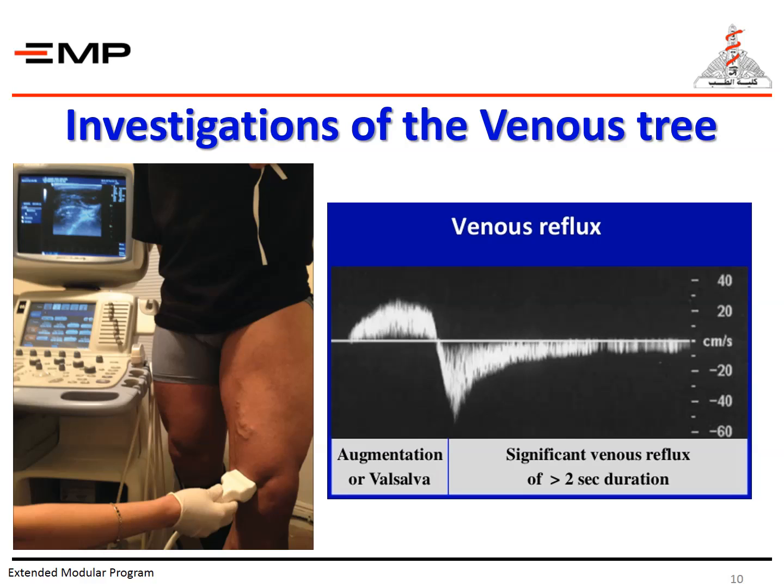Venous imaging can help in patients' diagnosis and decision-making by documenting venous obstruction if you are suspecting deep venous thrombosis, chronic venous obstruction, or documenting venous reflux, that is the reverse flow of blood against the normal flow.